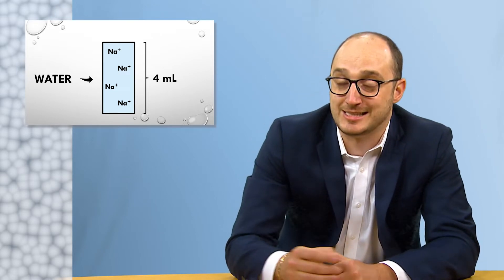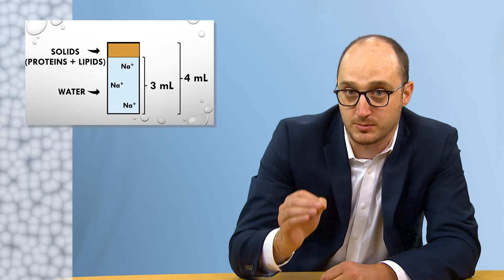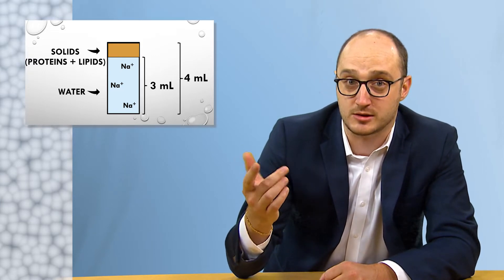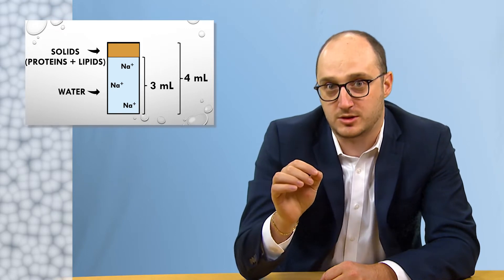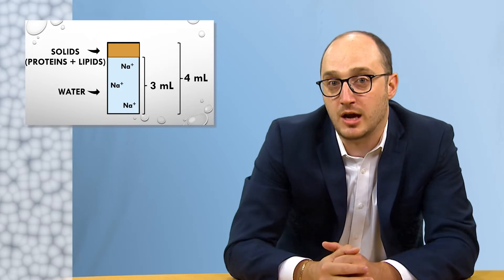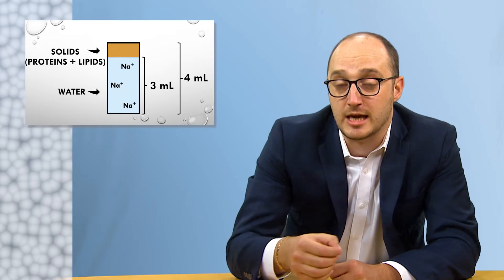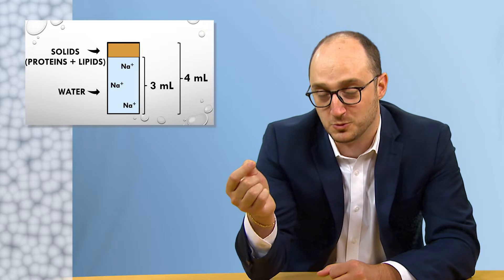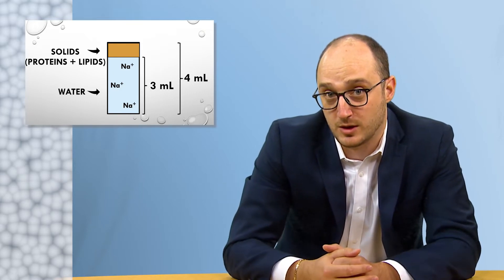Now let's take a different solution, one with the same concentration of 1 ion per ml, but that has 3 ml water and 1 ml solids like lipids or proteins. Because electrolytes like sodium are only distributed in the water fraction, we will have less total ions in the tube — 3 ions — but in 3 mls of water. If I drop an electrode in this solution, it also will read 1 ion per ml, because electrodes only measure ion activity in water.